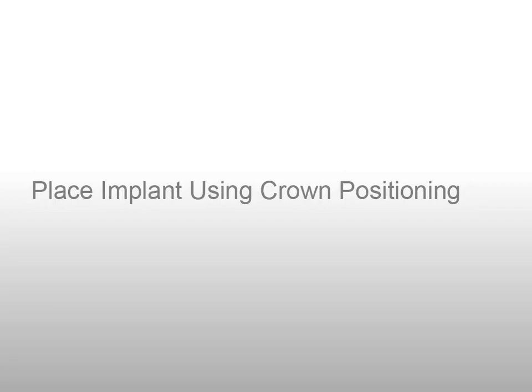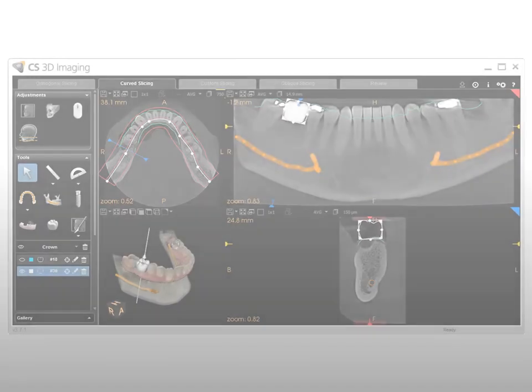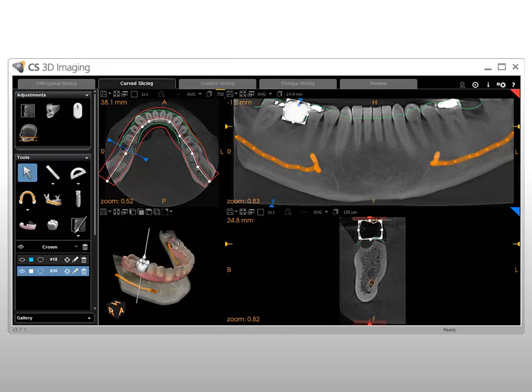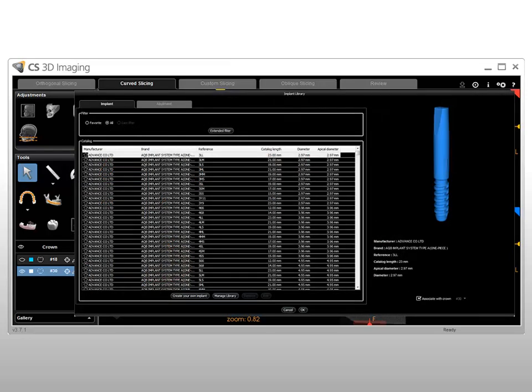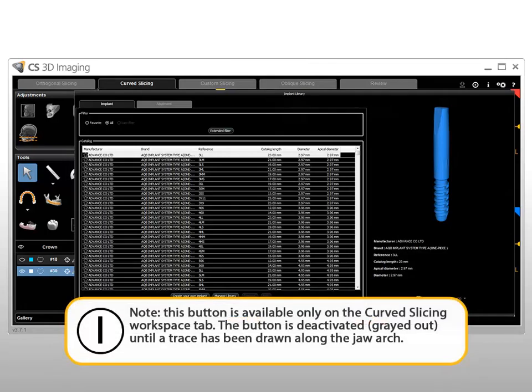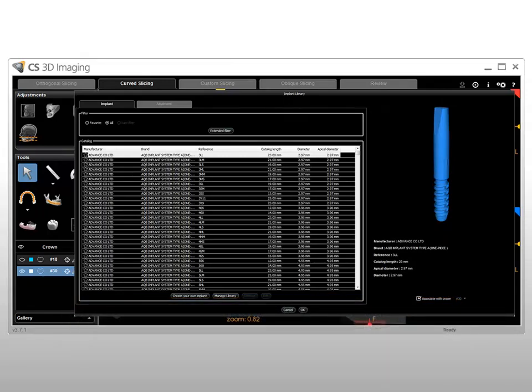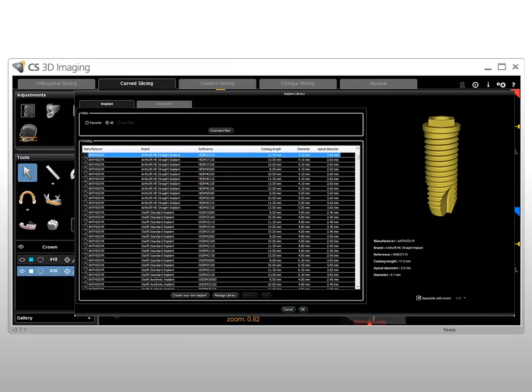To place an implant using crown positioning, CS3D Imaging Prosthetic Driven Implant Planning enables you to position an implant based on the final position of the crown. When you have placed a crown in the desired position, take measurements to calculate the position and size of the implant. In the Tools section of the Curve Slicing tab toolbox, click the Implant button. The Implant Library window is displayed. Note: this button is available only on the Curve Slicing Workspace tab and is deactivated until a trace has been drawn along the jaw arch. Scroll through the list of available implants in the catalog, using search filters to narrow the list.